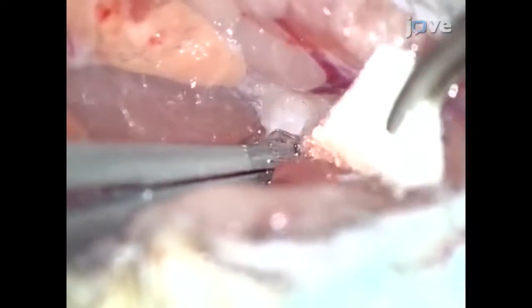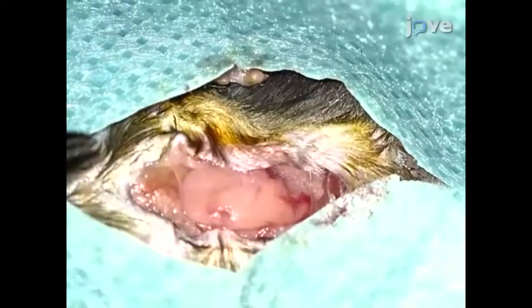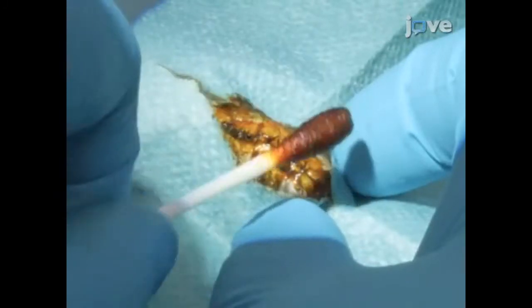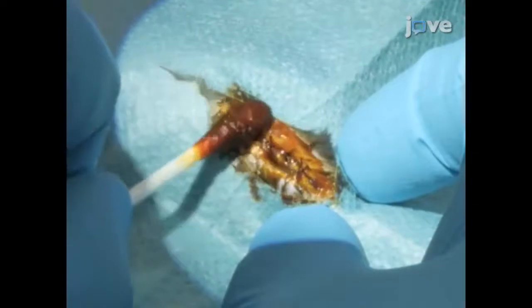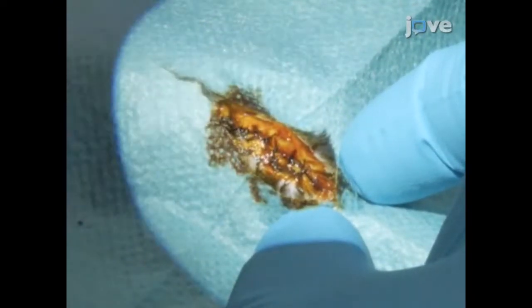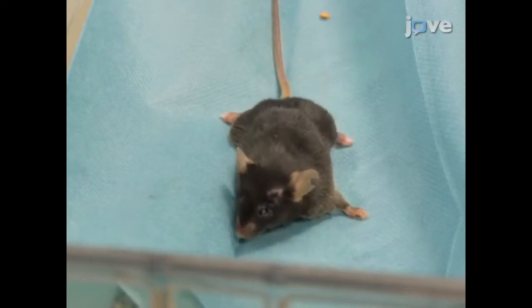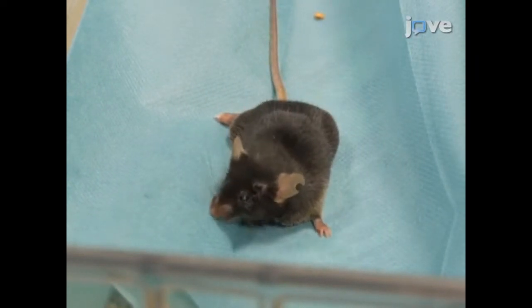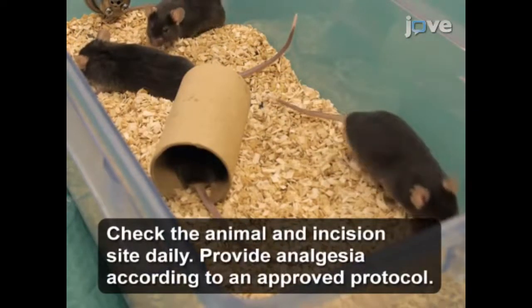Seal the bulostomy with 1 to 2 drops of tissue adhesive. Return the submandibular glands to their initial position and close the skin incisions with 5/0 silk surgical suture. Apply povidone iodine or chlorhexidine-based antiseptic around the incision to avoid wound infection. Keep the mouse on a heating pad until it has regained sufficient consciousness to maintain sternal recumbency. Return the animal to the home cage only after it is fully recovered.